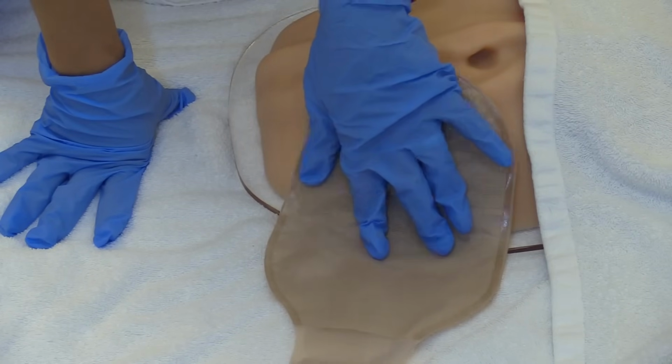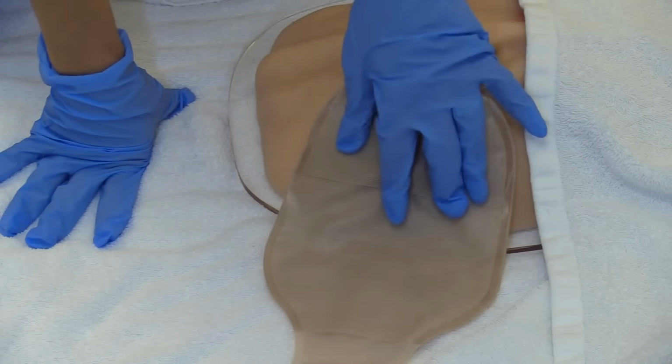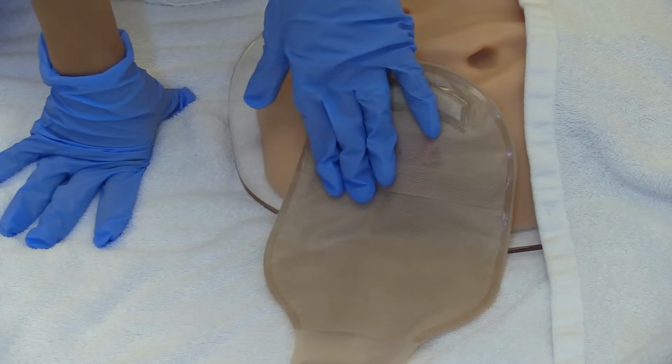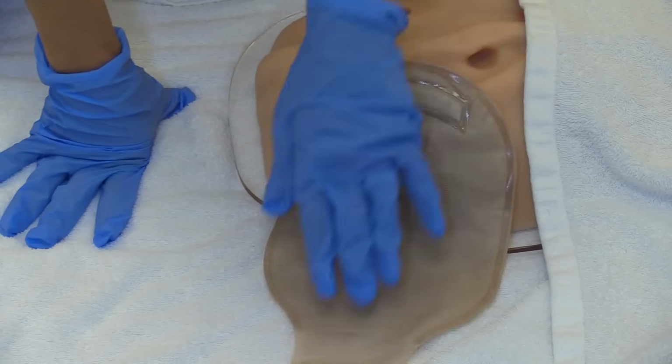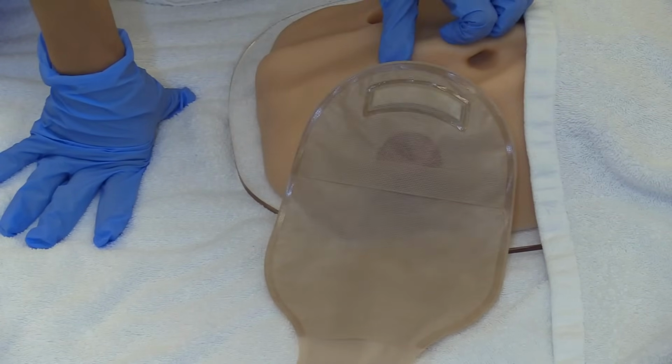And as the nurse, you want to be checking this as well, because our patients tend to wear those big bulky gowns, and they can occlude you being able to see if the bag's inflated. So you'll have to pull the gown back and actually look at the bag. So that is how you change an ostomy pouching system.